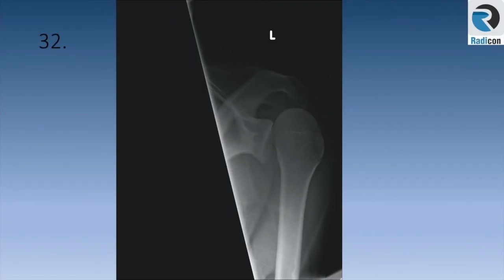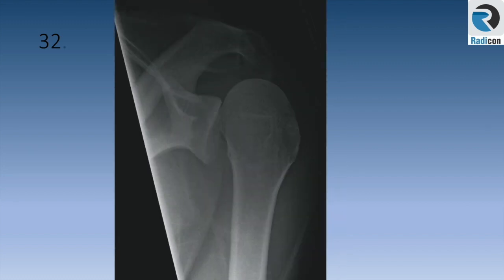Case 32. Left shoulder view. It shows loss of congruity of the left glenohumeral joint with the light bulb sign of the humeral head, indicating posterior dislocation of the left shoulder joint. This is another exam favourite for rapid reporting as well as the viva.